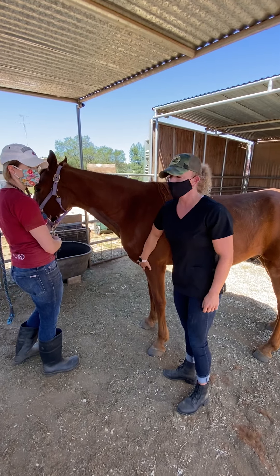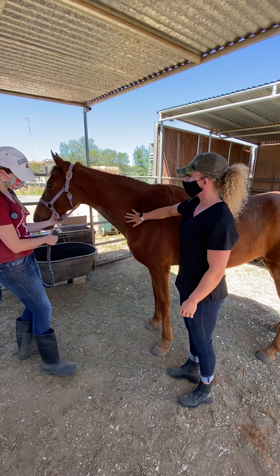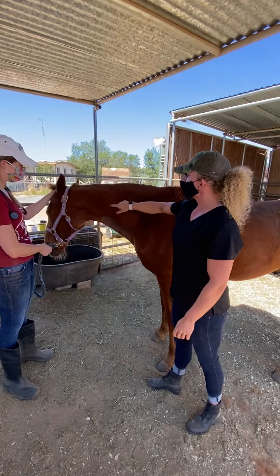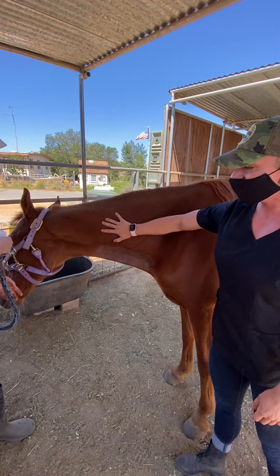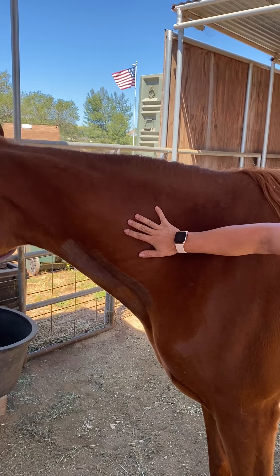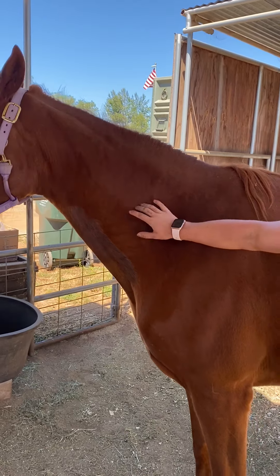We're going to talk about IM injections. There are a couple different places we can go. The first place we want to talk about is the cervical area. There are a couple things you need to be concerned about when poking up here in the neck. It is a great place to go with a lot of muscle, but there are a couple different things we need to talk about.